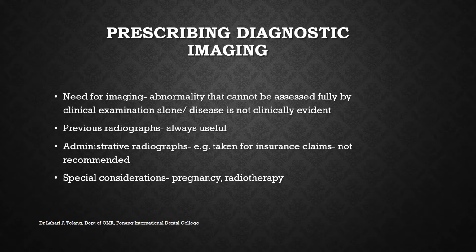Also, it's important to check any previous radiographs or previous imaging done. That's always useful to understand how the disease was probably a month ago or 2 months ago and how it is at the moment. Administrative radiographs, for example, taken for insurance claims, are something which I personally do not recommend, and they shouldn't be done too often unless they are absolutely mandatory. And of course, for radiographs taken with special considerations like during pregnancy or in radiotherapy patients, it's important to keep in mind that less is more, and always abide by the principle of ALARA.